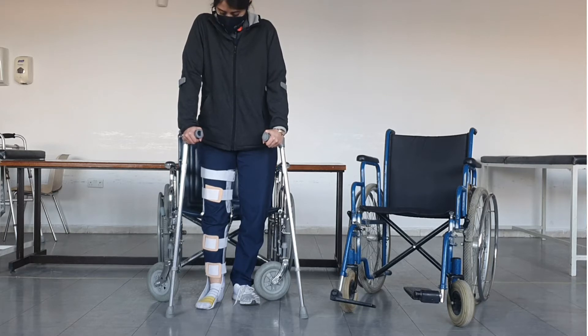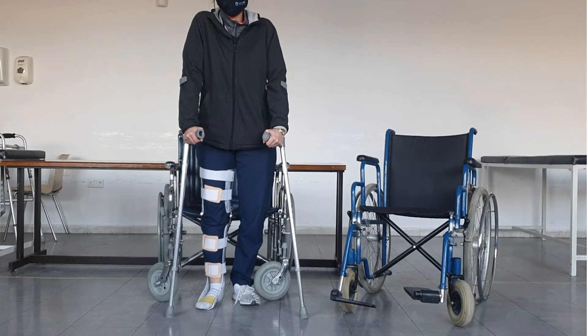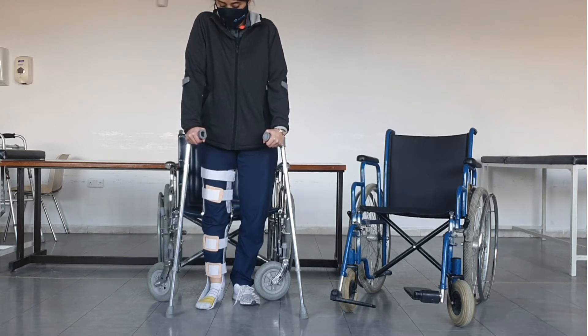The ultimate goal we need to reach with our patients — in particular patients with very low-level injury, and those with AIS D, maybe sometimes AIS C — is gait training. For gait training there are a variety of adaptive equipment that the patient might need.